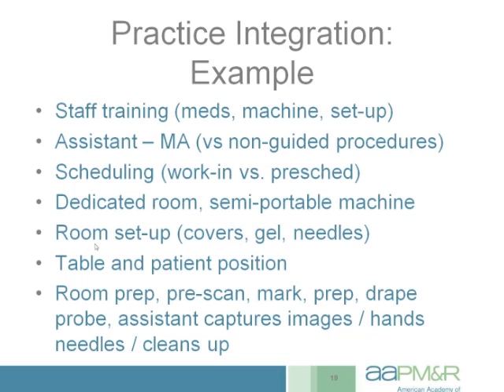We already talked a little bit about having an efficient room setup, having in the room what you need, so if you end up inadvertently contaminating your probe cover, you have more probe covers within a few feet reach, and you can grab a new one and be up and running again. We already talked a little bit about table and patient positioning.